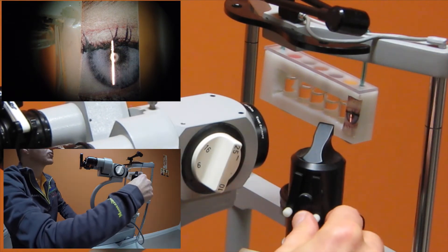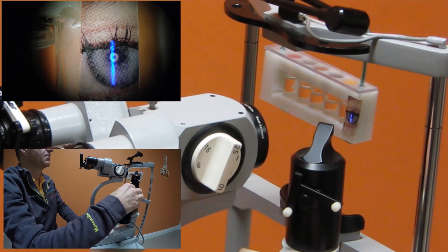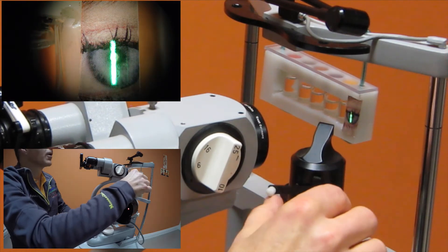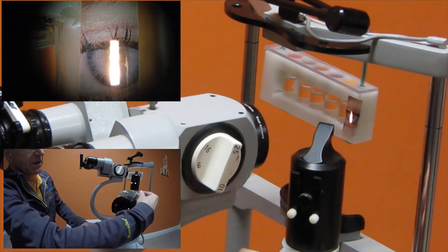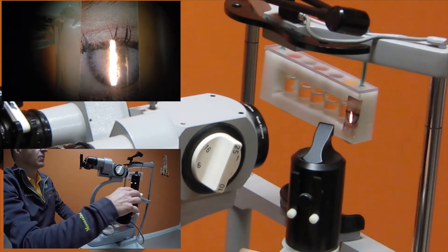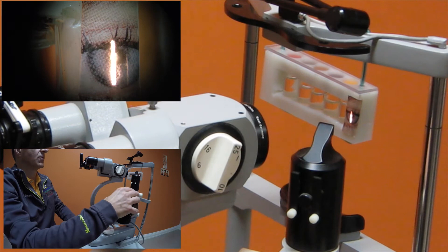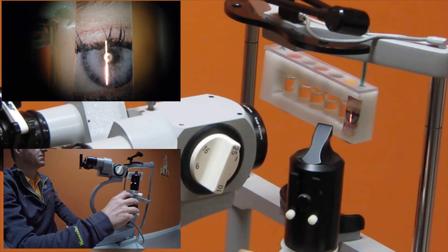Now, we can also change the beam to being a blue cobalt blue beam or a red free beam from the top. Again, center that. We have a nice wide beam at this point, nice tall beam. We'll make that smaller again. The beam can be rotated.